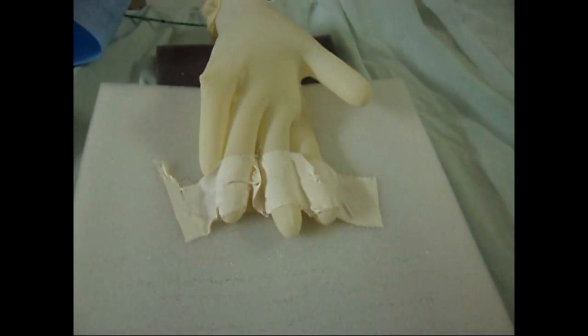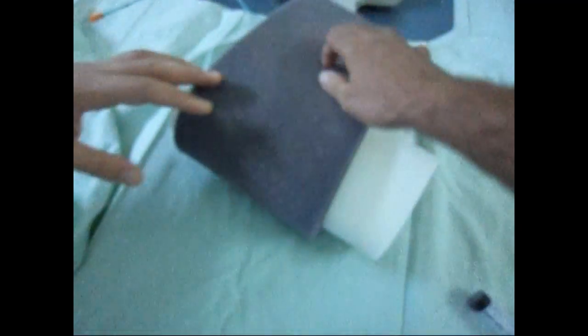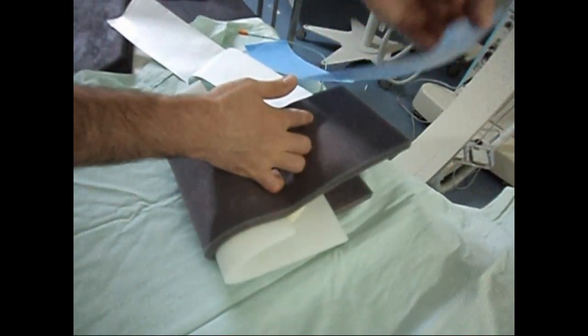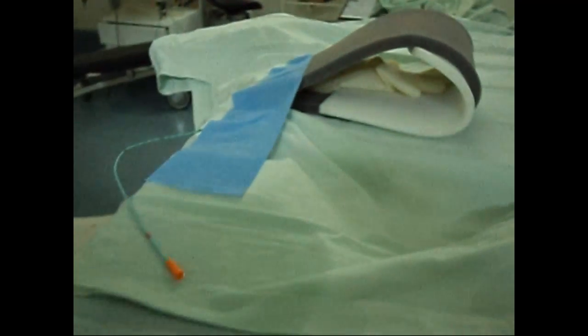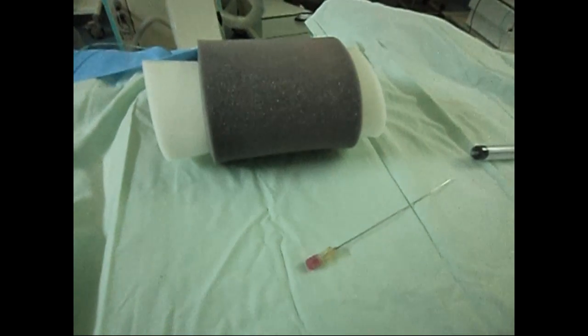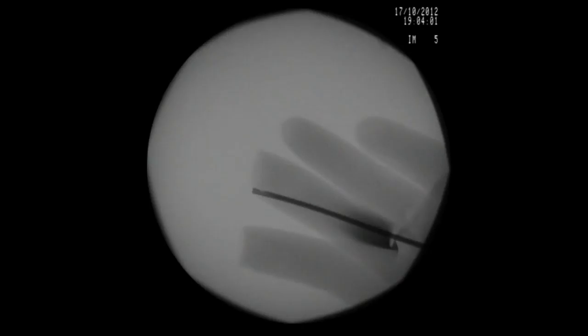The fingers are fixed to the foam using medical tapes. The foam layers are folded so that the glove is covered by the proximal half. Adhesive tape is used to fix the foam. The glove is then filled with saline and contrast media.